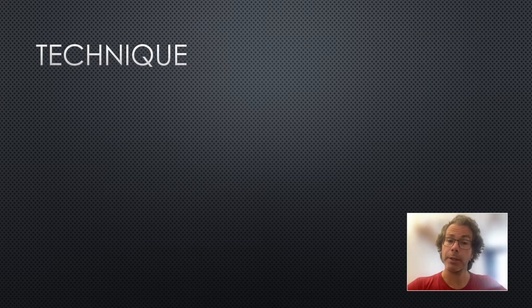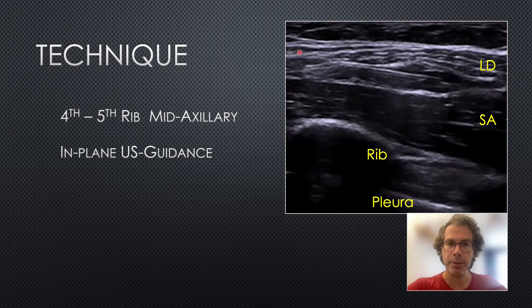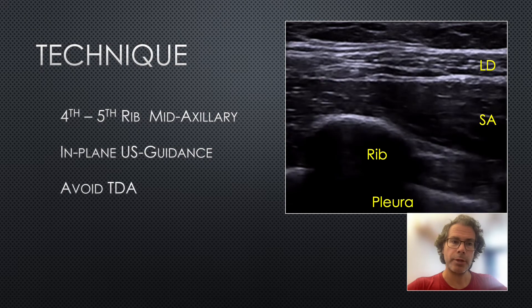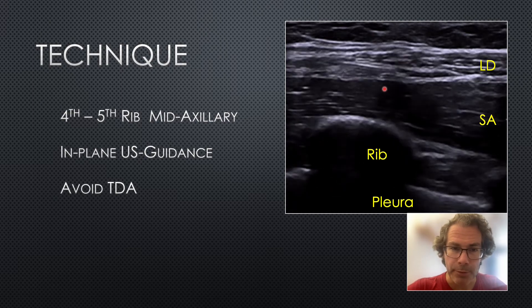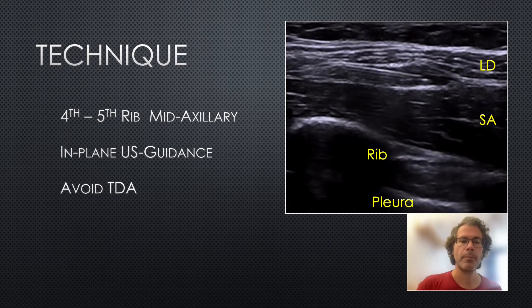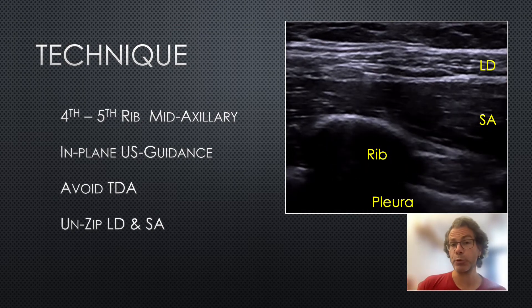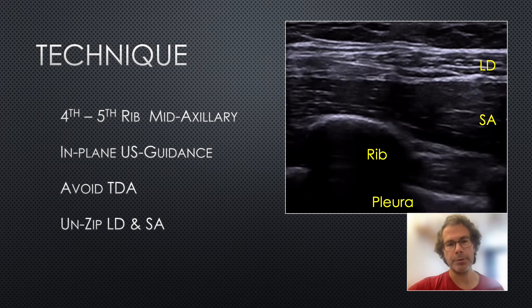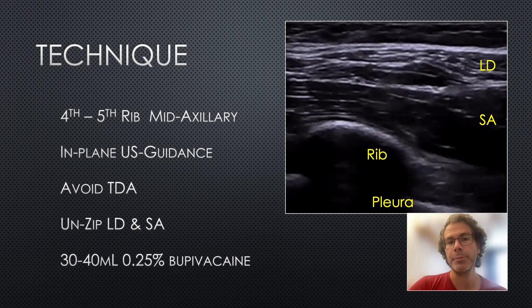In general, the injection is made at the level of the fourth to fifth rib in the mid-axillary line. However, there is some flexibility — if it's more the upper ribs that are fractured, you can go higher; if more the lower ribs, you can go lower. Always use in-plane ultrasound guidance. In this clip we can see the needle coming in from the left-hand side of the screen. If you can, try to identify and avoid the thoracodorsal artery — it can be quite difficult to see, but just plot your needle path well away from it. Once the needle is in the correct plane, as you inject your local anesthetic you should see the muscle bellies of latissimus dorsi and serratus anterior lifting off each other — they should unzip. Use between 30 and 40 mLs of 0.25% bupivacaine, to spread over a large area.